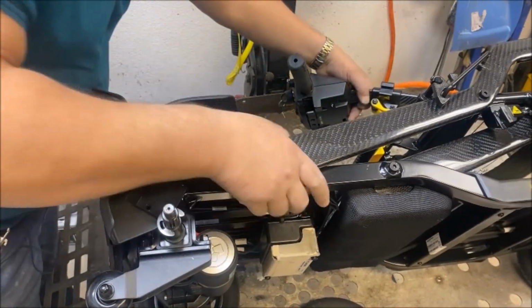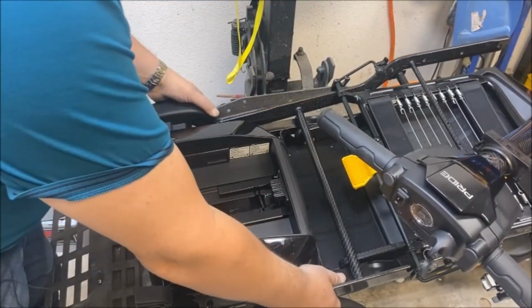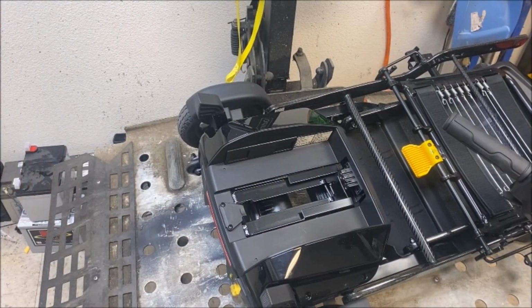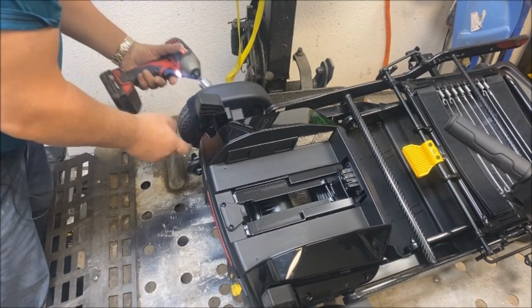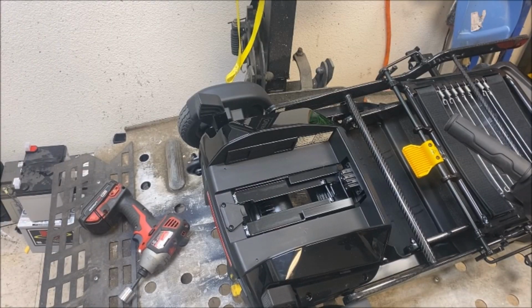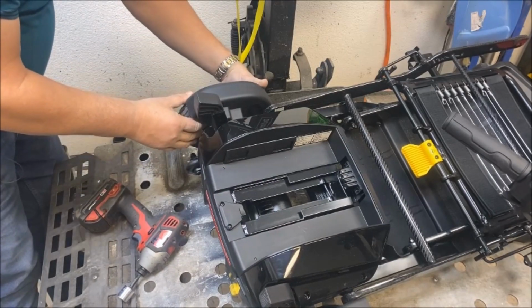I've got to get the other wheel off, so I'll just stop that from rolling, because I've got to get the other side off. Yeah, so 3/4 socket for the wheel nut, sorry. And that should release your wheel.